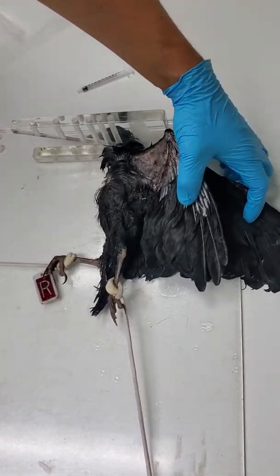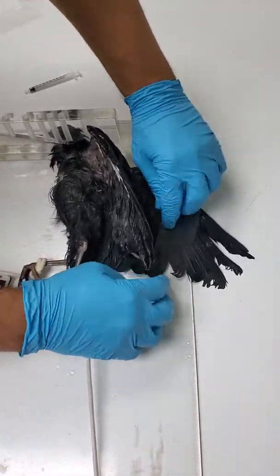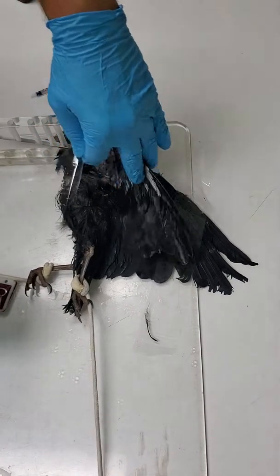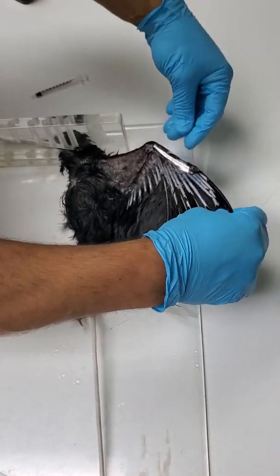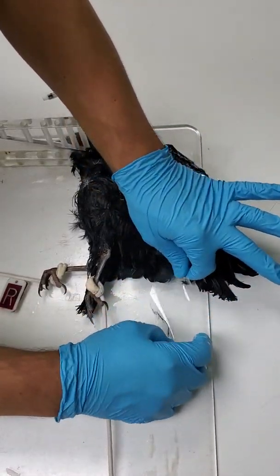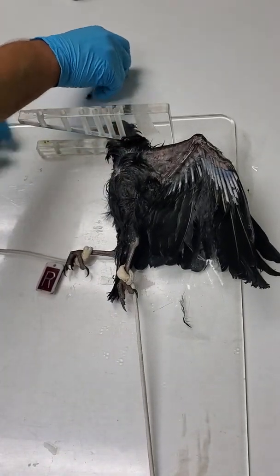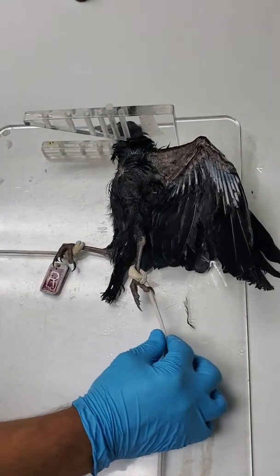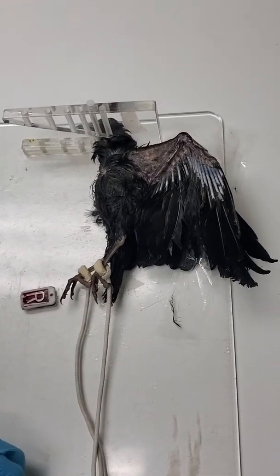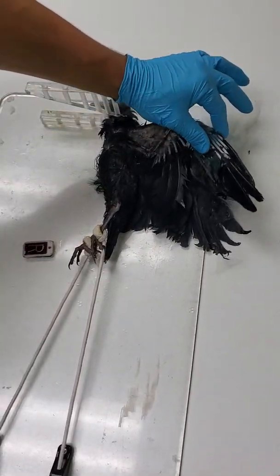If I don't want to be in the beam, I could tape the wings down. Because you don't want to hyper-extend the wing, you have to make a loose loop over the wing so that you're not actually pinning them to each other. Then I could either pull them ventrally and caudally, or pull them both back like this. I just attach them to the little attachment like so, and make sure that I'm collimated, then take my shot.